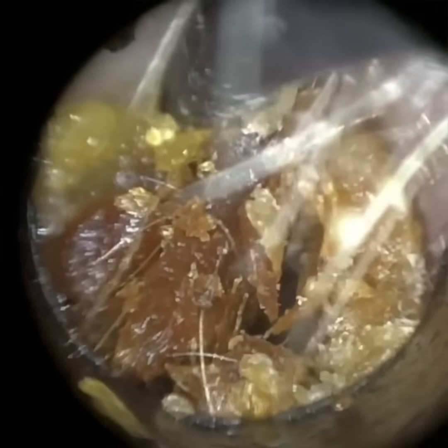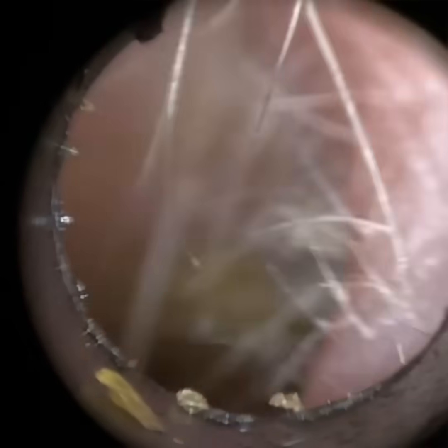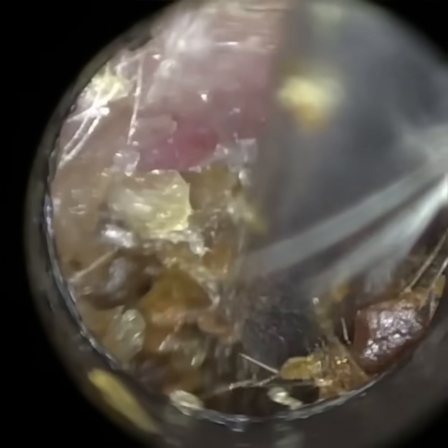Now, with the endoscope, again, it's monocular vision. You're looking at a 2D screen, although you can get 3D endoscopes. But it doesn't mean you can't get depth perception. I think that's where the misnomer is. If you've been watching my other channel, the Wax Whisperer, where I'm using the iClearScope, you can see that I've got depth perception with that, and I've acquired it.